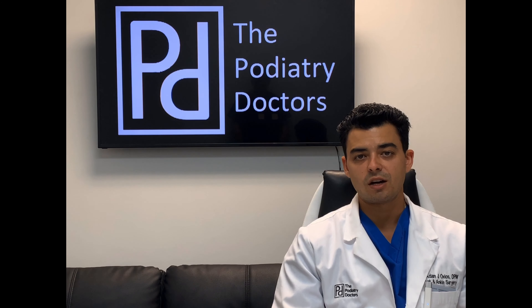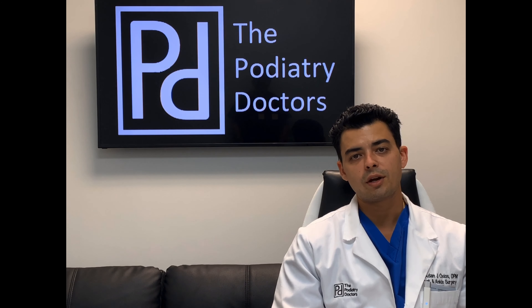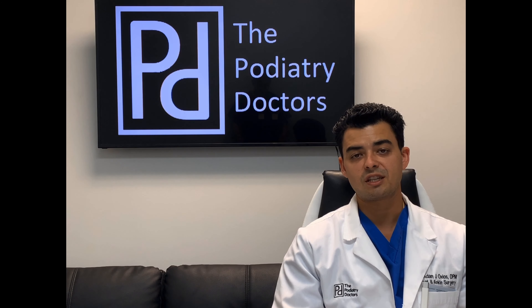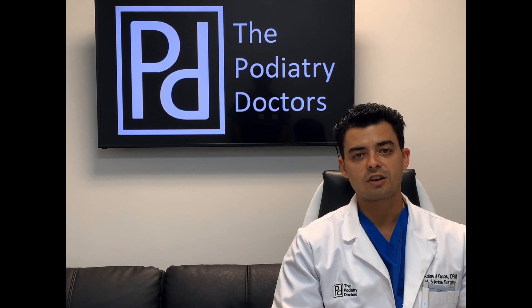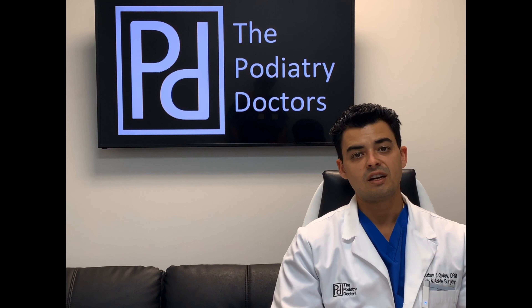Hello, my name is Dr. Adam Oxios. In today's video we are going to discuss how to apply a posterior splint. Similar to the modified Jones compression splint, I like to use a light layer of compression prior to the posterior splint material being applied. This is great because it helps us manage edema, and my residents know that this is vital if surgery is to be performed in the near future for that patient.